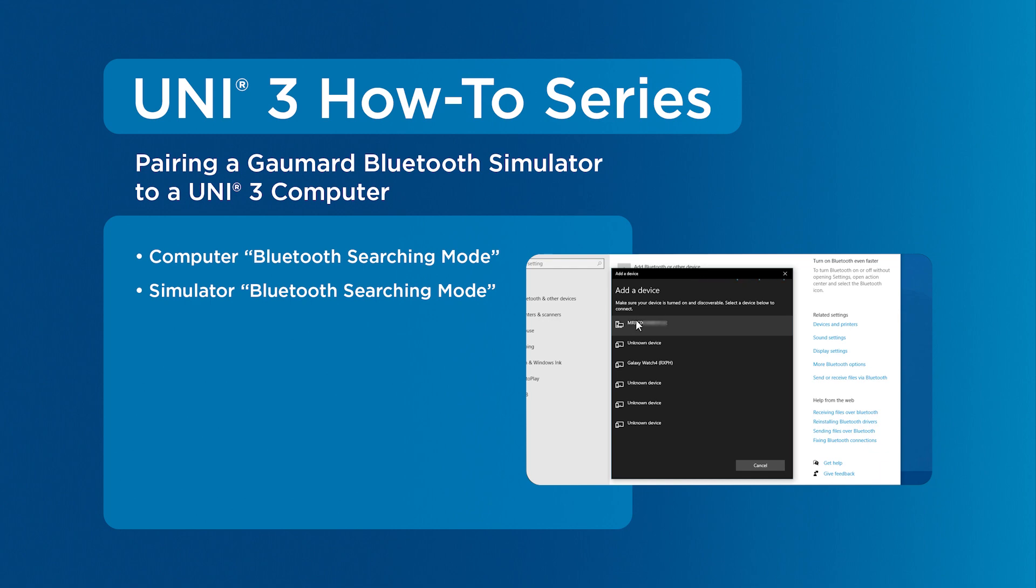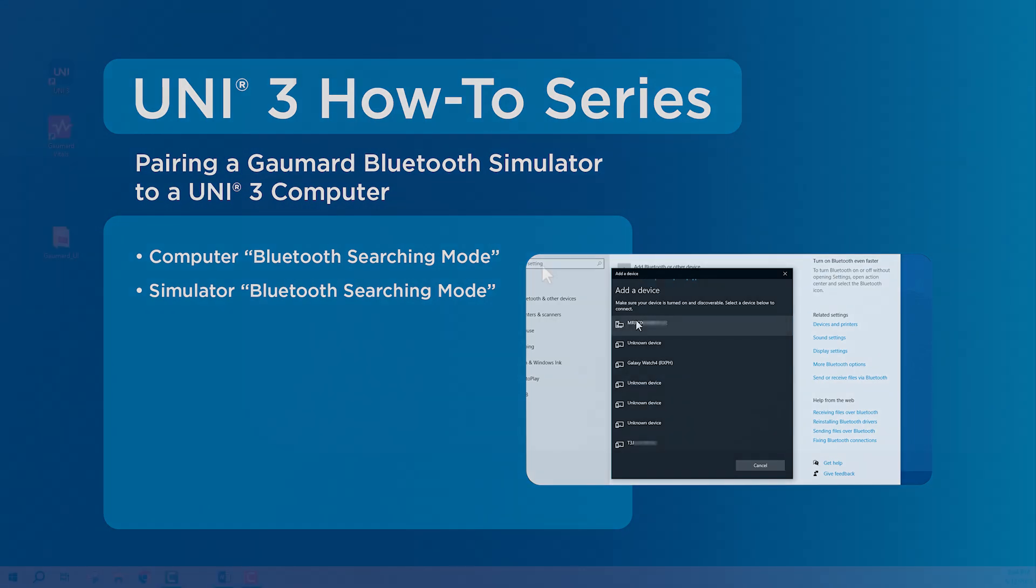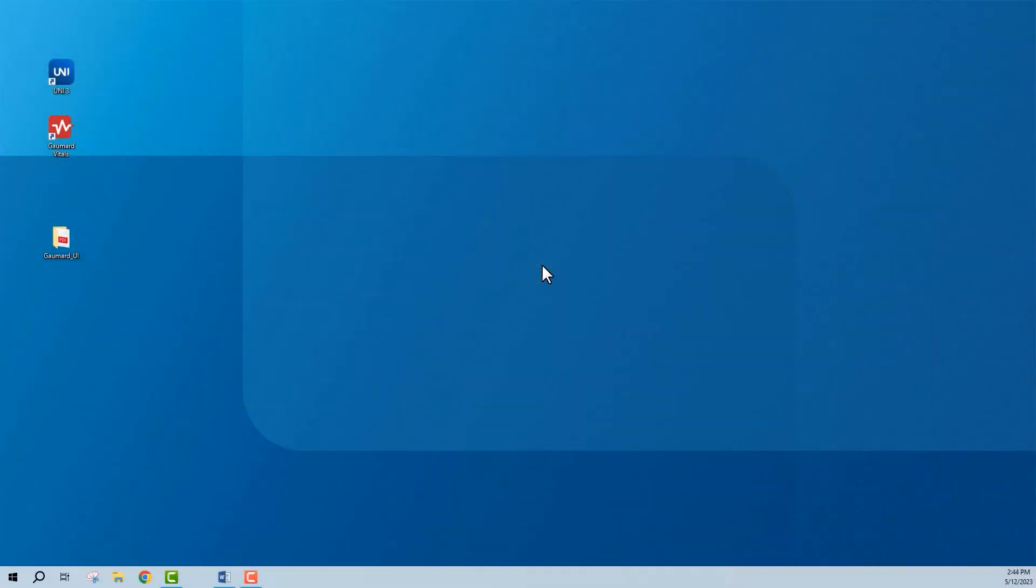Bluetooth pairing is a simple process that allows two devices to communicate wirelessly. Some Gaumard patient simulators are Bluetooth-capable and others can use Bluetooth by utilizing a Gaumard Bluetooth dongle.